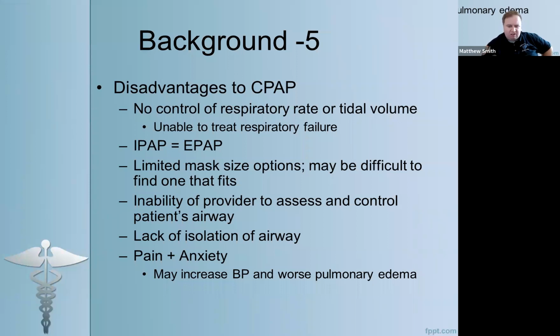We will see a declining respiratory rate because they're tiring out. So if you have either of those two things, a change in mental status or a declining respiratory rate, you cannot use CPAP. You cannot use this treatment for a patient that is bradypneic. You cannot use this treatment for a patient that is severely hypopneic.